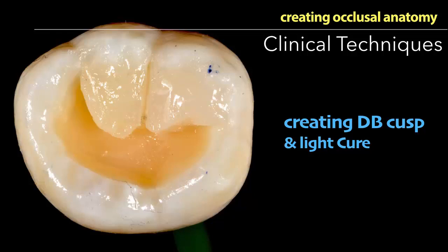Then the next cusp is the distobuccal cusp. It has a proper triangular shape, so you cannot adapt it in a rectangular way. Keep the limits of the cusp in mind. You cannot extend the composite onto the neighboring cusps, so you have to maintain the margins, and that is only possible with proper training. Don't over-contour it. Align it along the walls, never above the walls. You can see the margins are very clear here, with no overhanging composite.